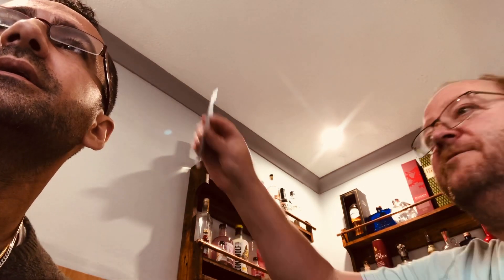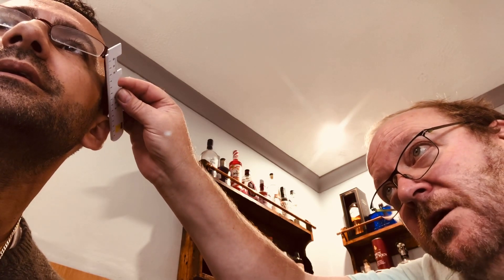There is another measurement that can be done now — this is called the vertex distance. What I'm actually looking for is the back of the lens to go level with the cornea, so the front of your pupil. In this particular case, that's 11 millimeters on that frame. A different frame will have a different gap, and if you've got more than five diopters of prescription, that gap can alter the prescription.